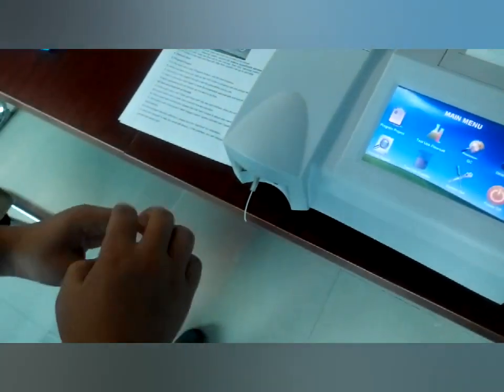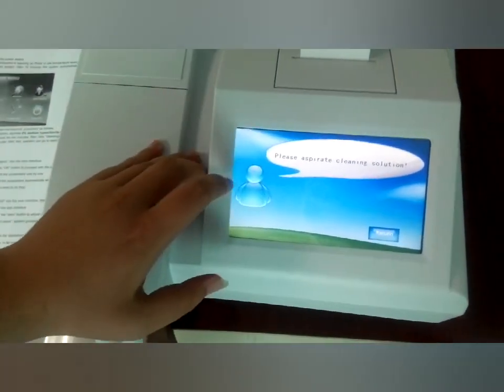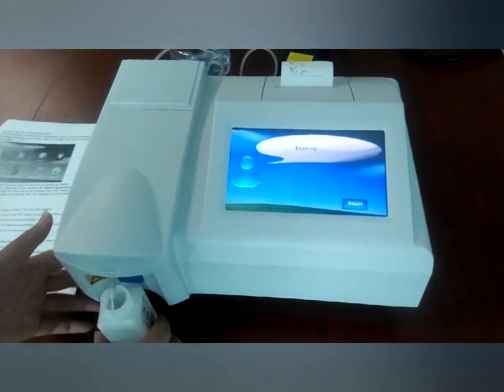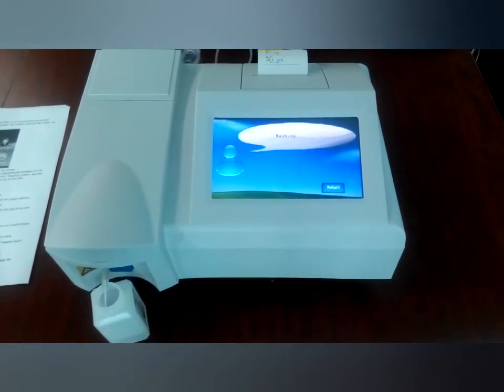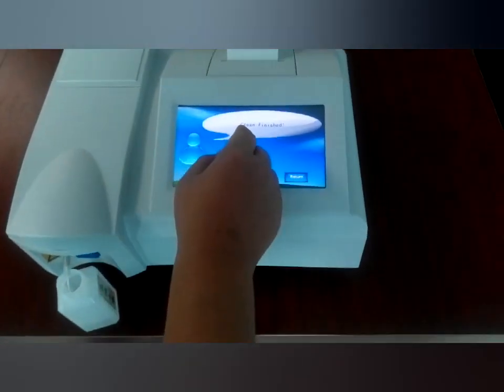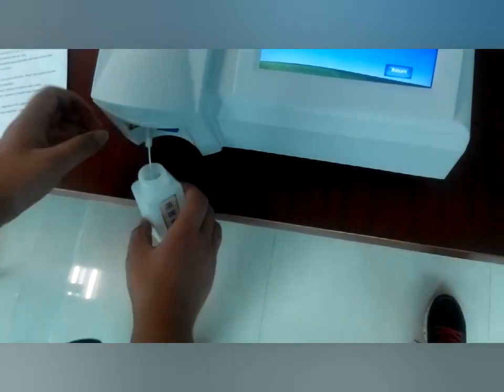First, we need to use the 5% sodium hypochlorite solution. You can see the water level here and it creates a clean solution. Now it shows 'clean finished' and we just return. The second reagent is distilled water to clean the tube and the flow cell. We just click it, use the distilled water, and click here.